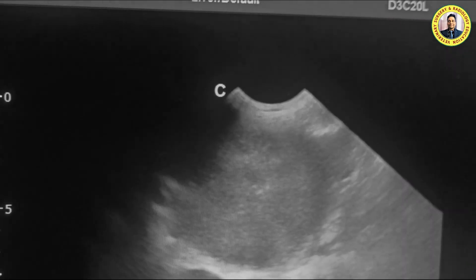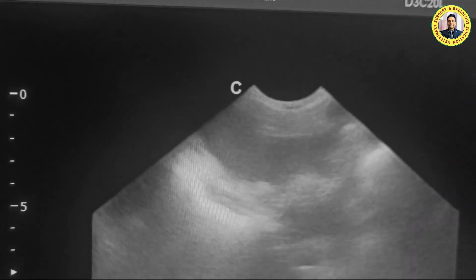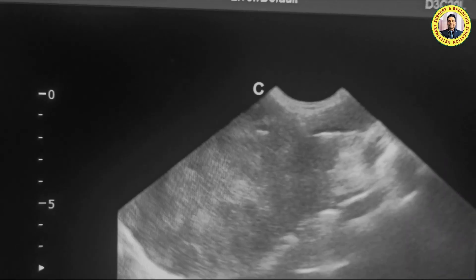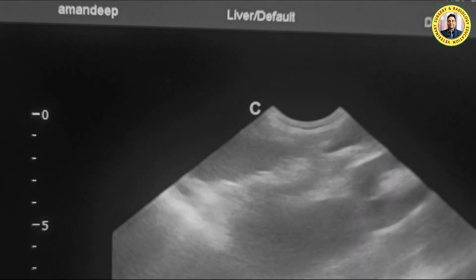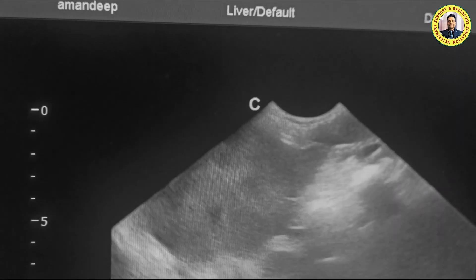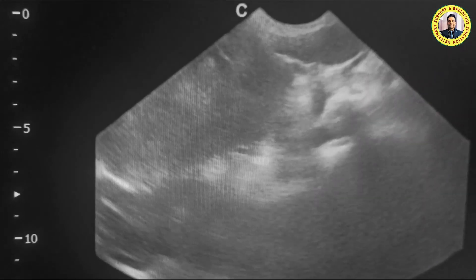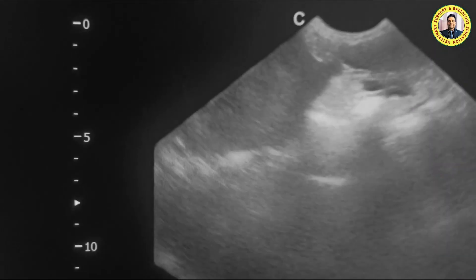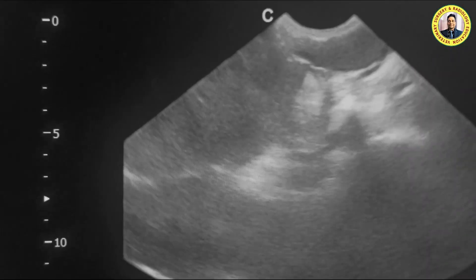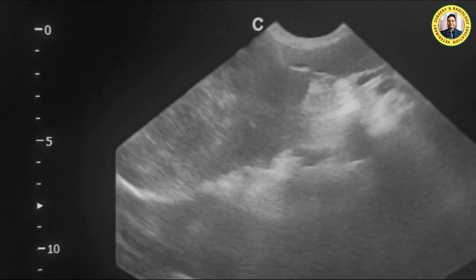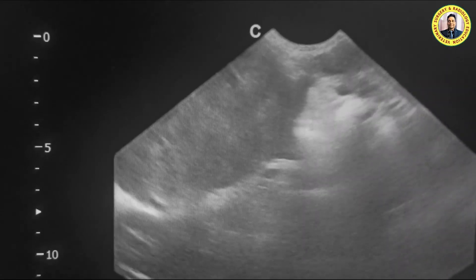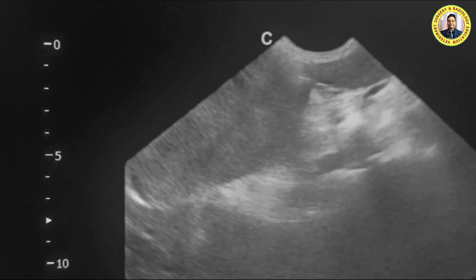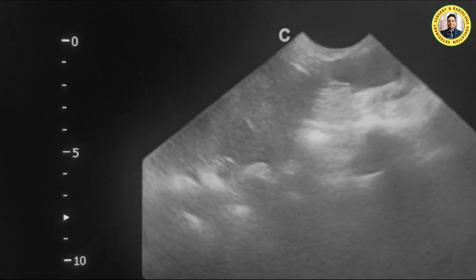Upon radiography it is clear that it is basically originating from the spleen. Now you can see here — this is the spleen. It appears that this mass is arising from the spleen.